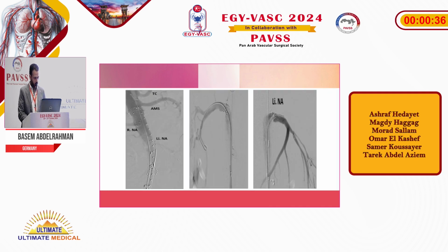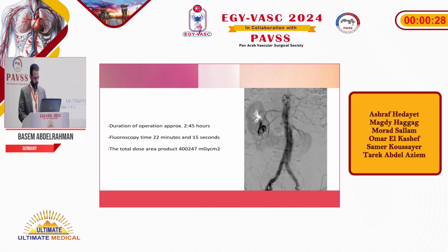This slide shows the intraoperative fenestration of the renal arteries and the complete deployment of the Anaconda stent, and the intraoperative control after complete deployment of the graft. The duration of the operation was approximately 2 hours 45 minutes with a fluoroscopy time of 22 minutes.